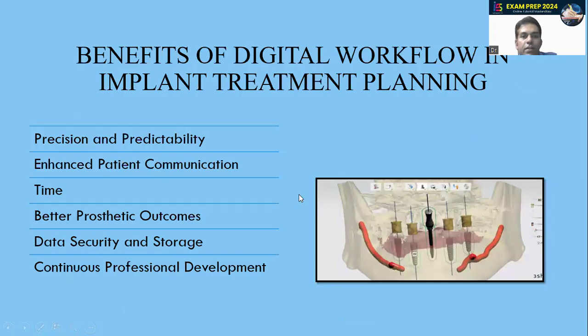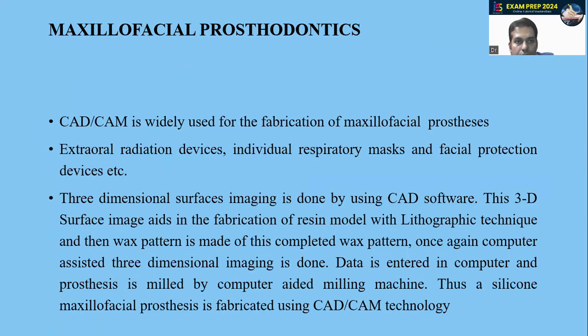Now, regarding the benefits of digital workflow in implant treatment planning, first of all, precision and predictability is high. Enhanced patient communication is possible. It will save time. Better prosthetic outcomes can be seen. Data security and storage is possible, and continuous professional development will be seen with the help of this digital workflow.